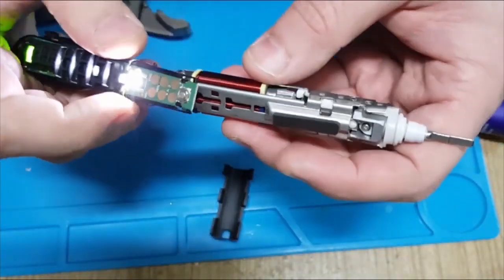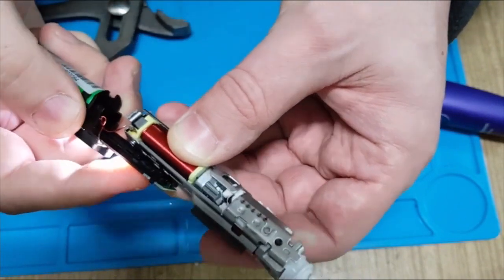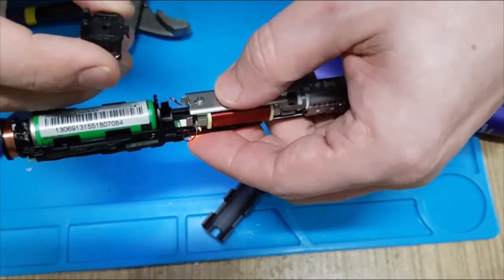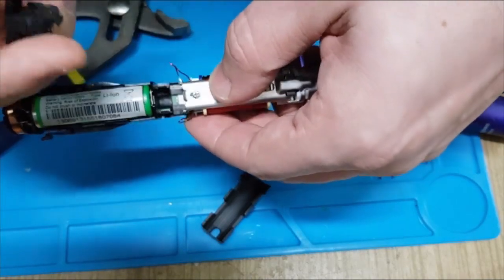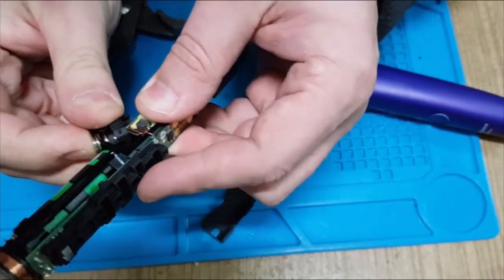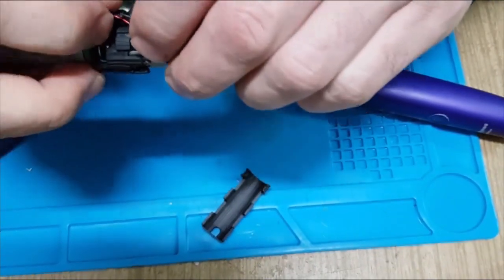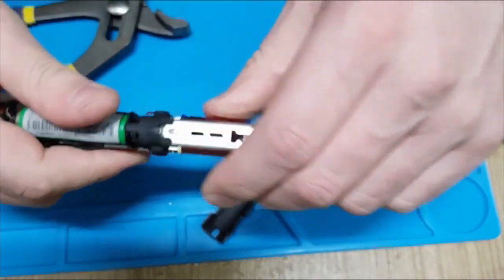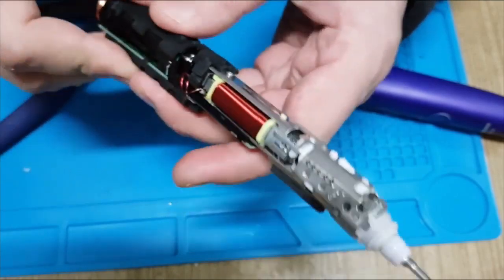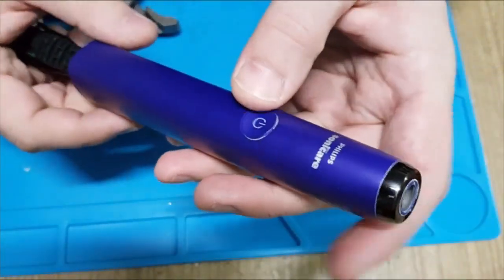So let's put it all back together. You need to align the teeth into the spaces and press it, slide and push it in. That's it. Then let's assemble it back, all the parts into their places. Put the wires away, and when everything's in place, we can assemble it into its case.